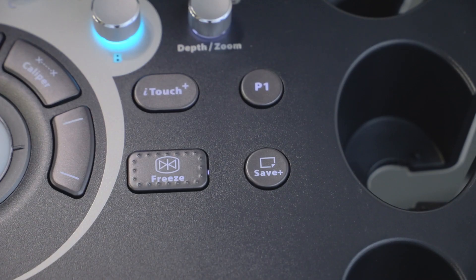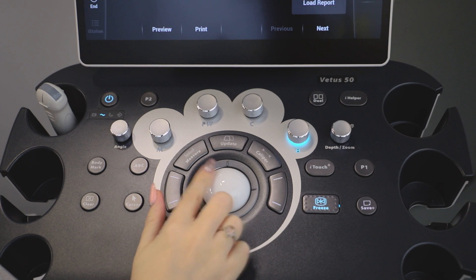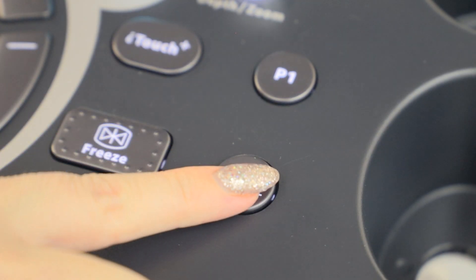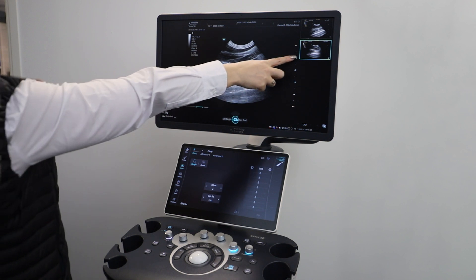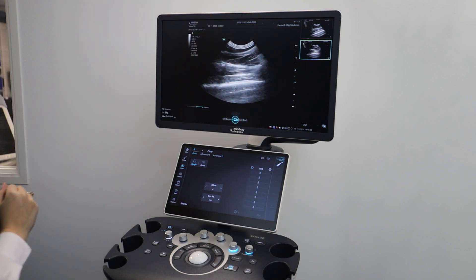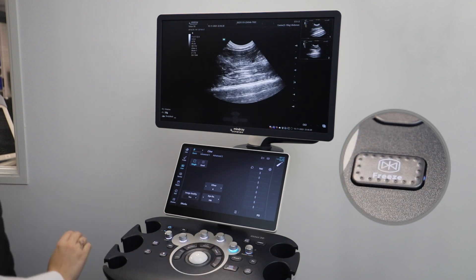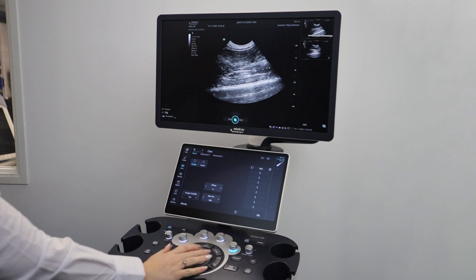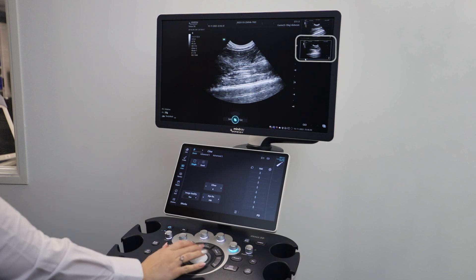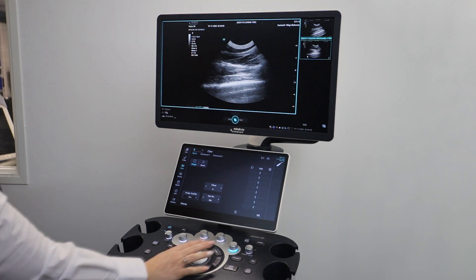To freeze your image, press freeze and you can scroll back should an earlier frame be of better quality. Once you're happy with the image, click save. The saved image will then show on the right hand side of the ultrasound image. To review the image, come out of freeze, click cursor, and use the trackball to scroll over the saved image tile and hover the cursor over the image for it to show up on the screen.